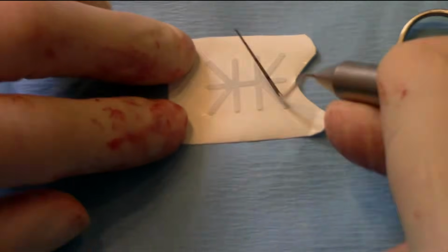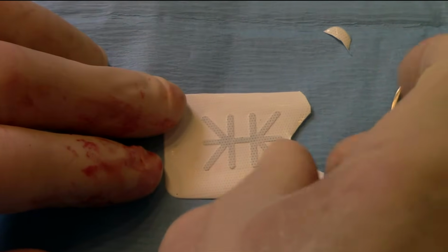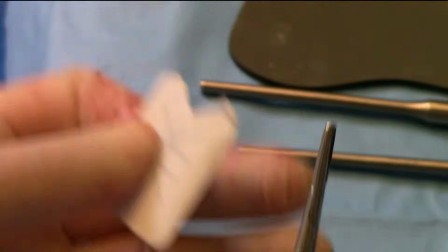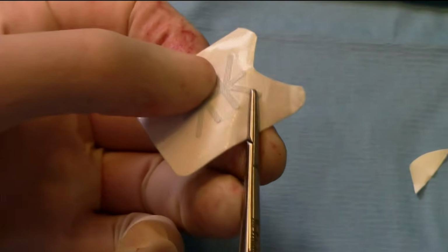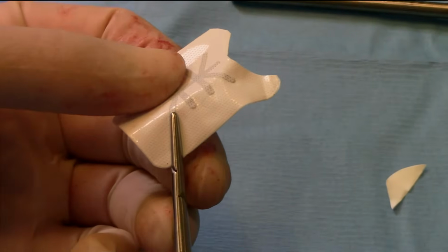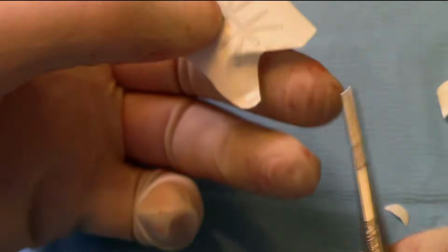And then we want to build the ridge, so you can see the width. That's 15. That's a lot of bone. We don't need that much. So I'm going to trim. You okay? Okay. You're doing great.